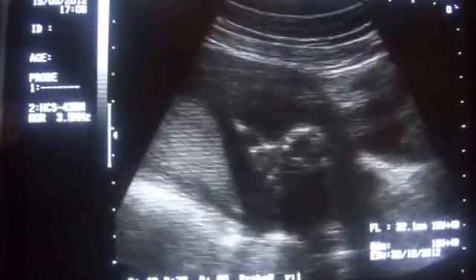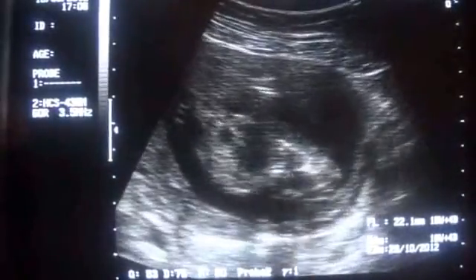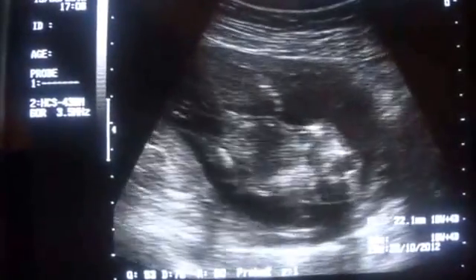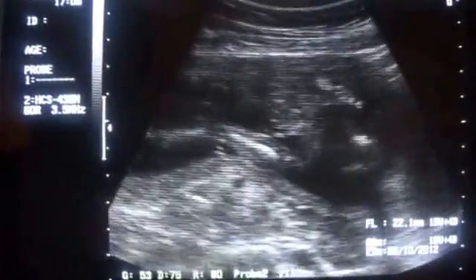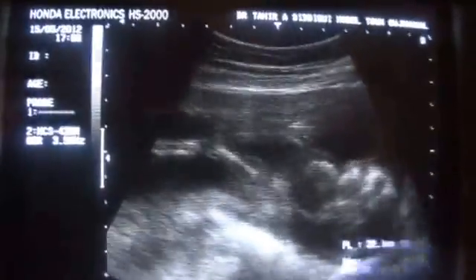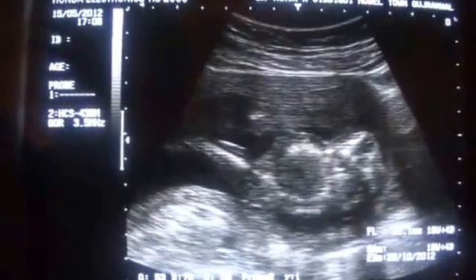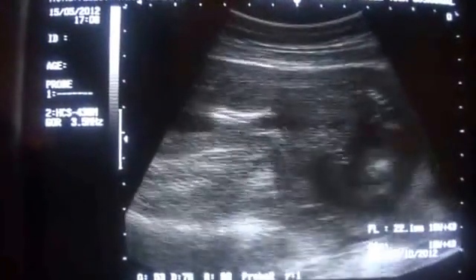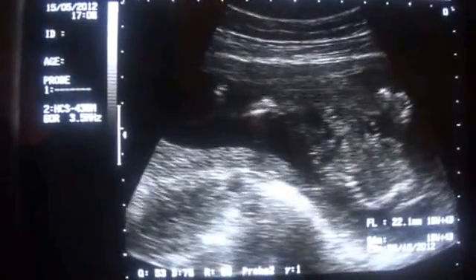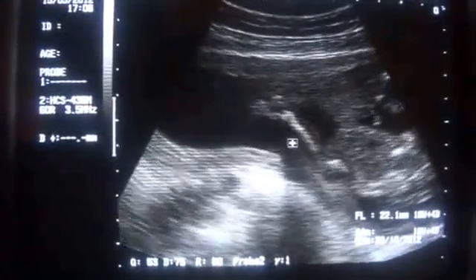So anencephaly is there, and this is a case of multiple pathologies. Anencephaly with omphalocele. This is the poor development of the vertebral column at this stage. This is the vertebral column, this one, this area.